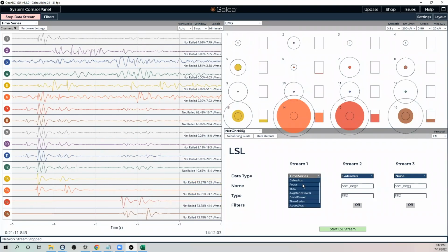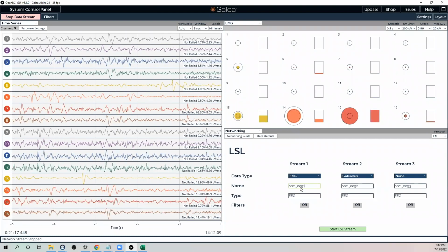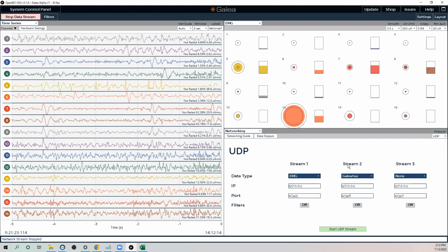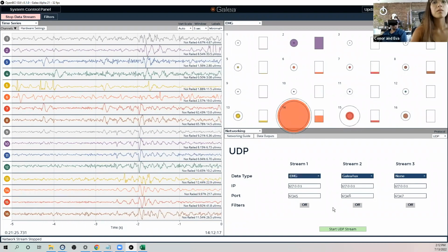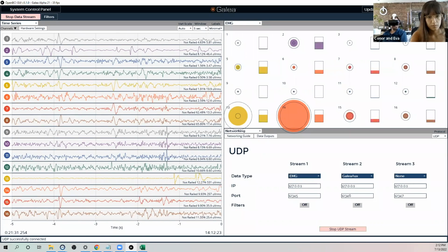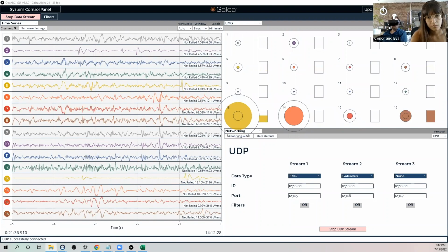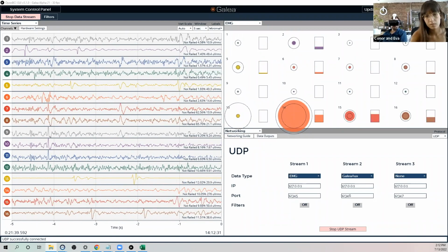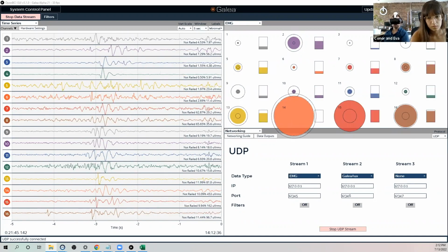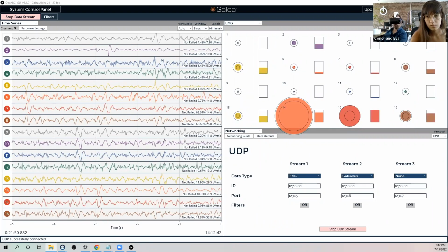Did we designate Galea as a medical device or engage with any regulatory systems? What certifications do we expect to get for Galea? Any partnerships with doctors? That's sort of one combo question. At the moment, no. Though we are very interested in deploying Galea or a derivative of Galea to help people in a clinical or medical context. I think at this point, we're really just focusing on building the hardware and building the building blocks, but definitely open to collaborations and partnerships that can help get Galea being used meaningfully by people who need it.